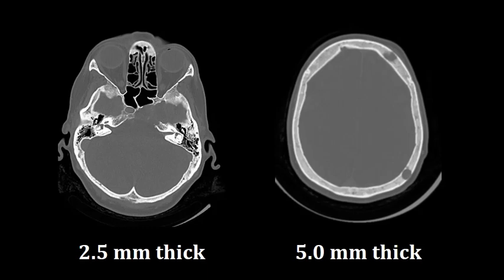When we look at the 5 millimeter slices, these slices are thicker, therefore they have less spatial resolution, but they also have less image noise. This is acceptable in the upper portions of the cranium where bony detail is not as essential.